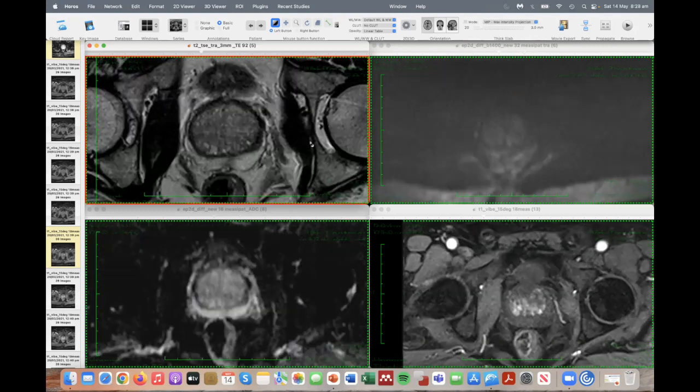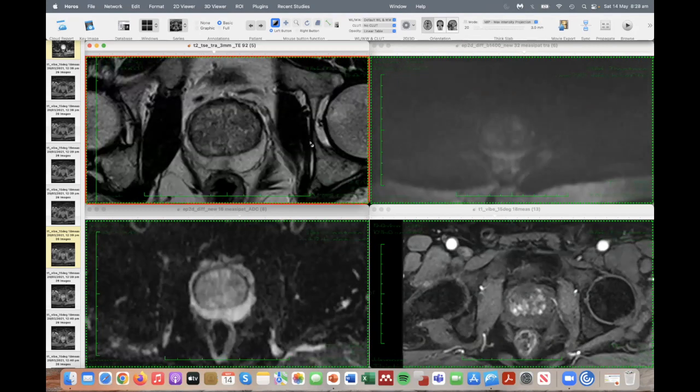Declan, do you do anything different? No, but certainly we would want to know a little bit more about the biopsy. It was a grade group 2 cancer, but the percentage pattern 4 and the presence of cribriform morphology or not would also be really important determinants of suitability for surveillance as well in our practice. Yes. Sorry, back to you, Francesco.